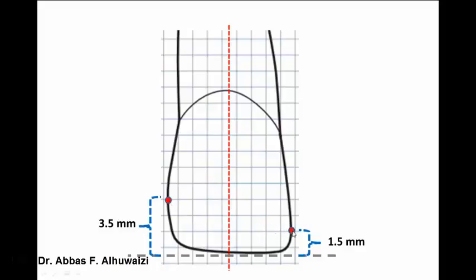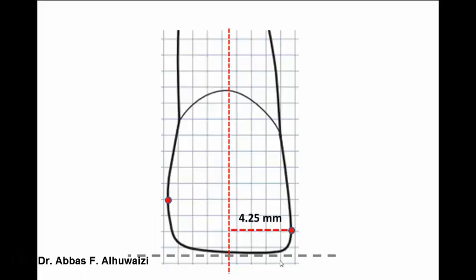The width of the crown between these two points is 8.5 mm. Therefore, it is 4.25 mm from the mesial peak of curvature to the midline, and 4.25 mm from the distal peak of curvature to the midline.